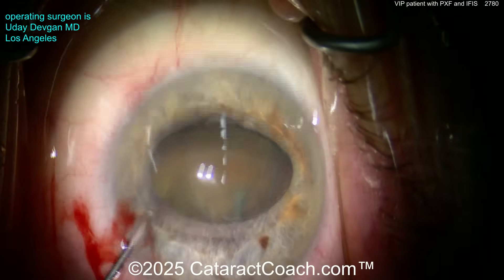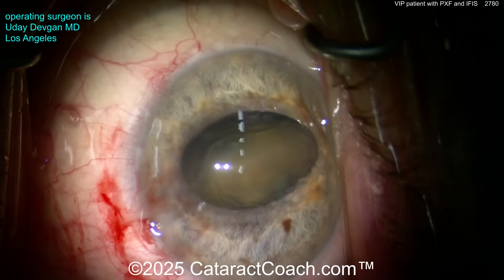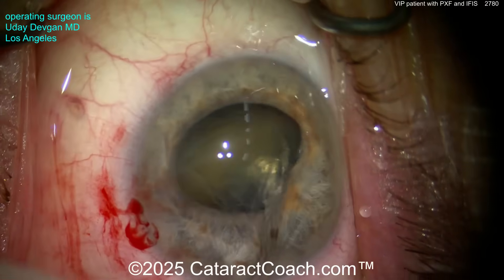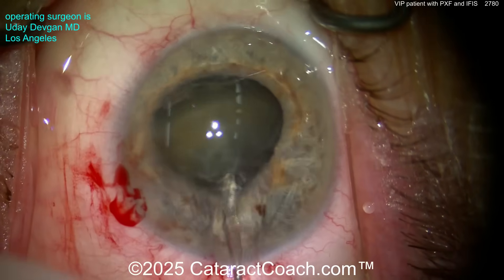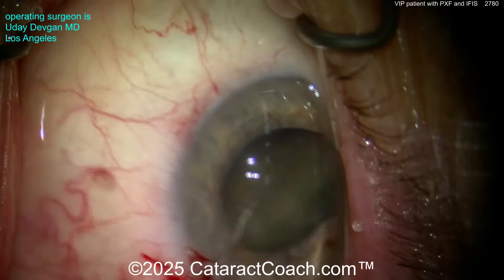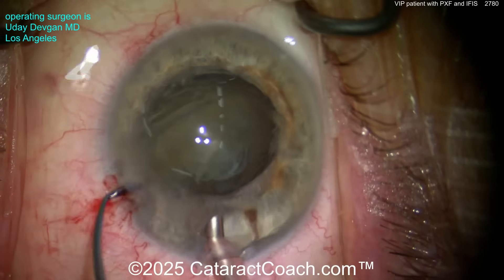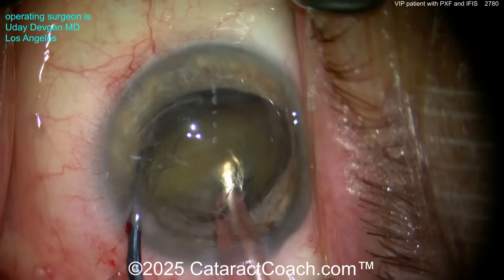Here's the nucleus out of the capsular bag. Going into the side port with a little more viscoelastic behind the nucleus — we're going to have the pupil hold the nucleus for us. Back to regular illumination, look at the Purkinje image: three dots now — the two similar dots are the coaxial and eyepieces, and the one other light is the paraxial. A little more viscoelastic to protect the cornea and endothelium, keeping that nucleus up. Notice how the nucleus is tilted partially out of the capsular bag; I'm using the pupil to hold the nucleus for me. Now taking the phaco probe inside the eye with the right hand and buzzing in, with the chopper going around the backside to split the nucleus.